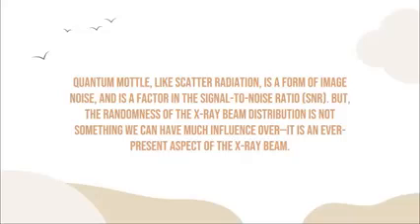Okay, now, what's the deal in SNR or signal to noise ratio? For digital imaging systems, CR and DR, appealing siya sa mga exposure factor. Okay? Pag taas sa signal to noise ratio, that means that your signal is taas and your noise is baba. So that means your image will become gwapo ang quality sa image.